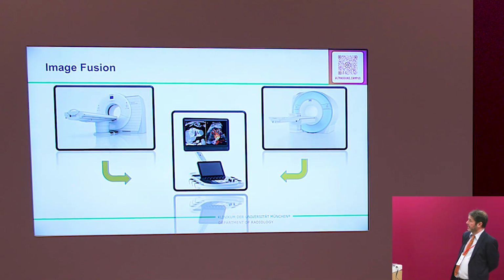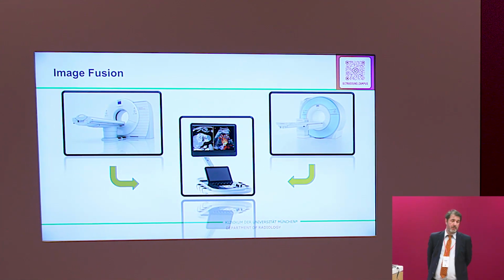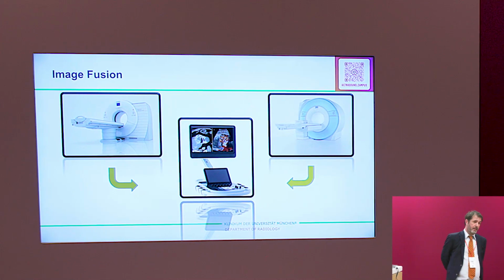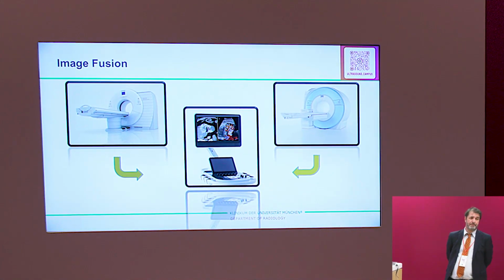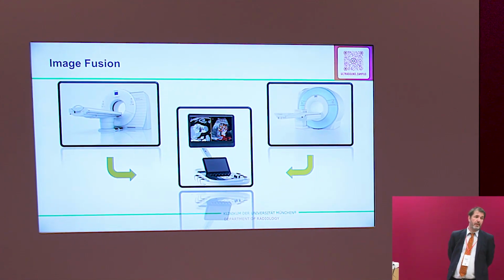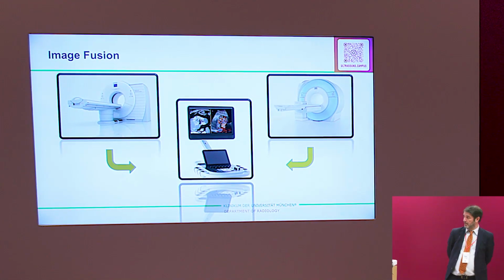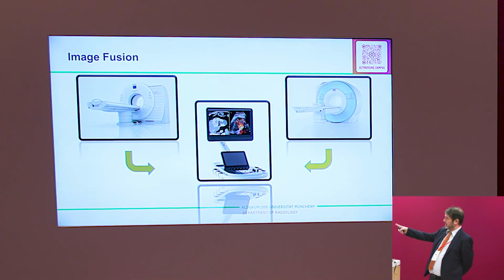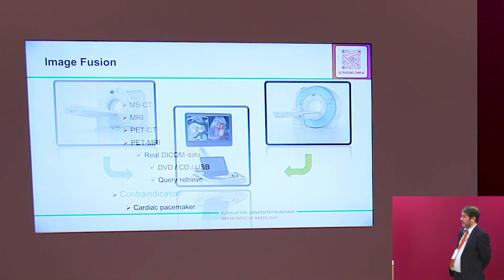So you see already here, we have got the MRI, we have got the CT. And of course, these are great, expensive systems, and they produce very nice images. So why not combine the strengths of MRI or CT in your ultrasound system? You see already a CT and an ultrasound image on the screen, but I will show you how it's working.